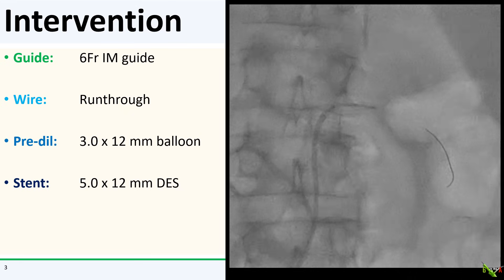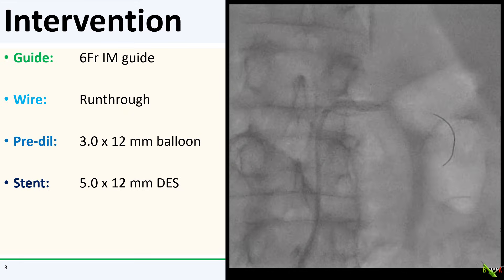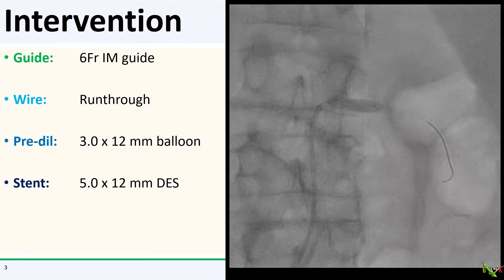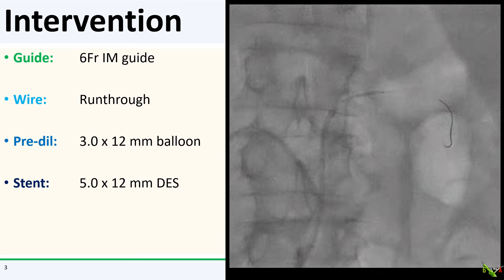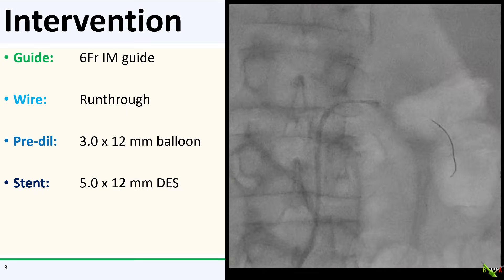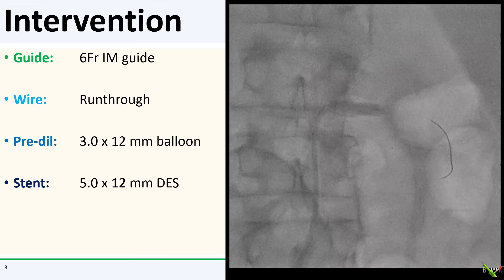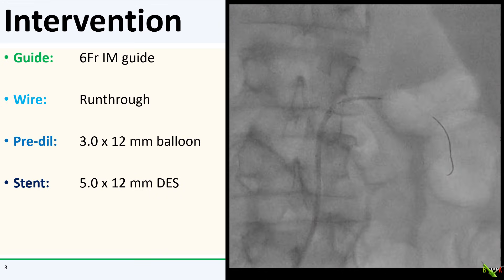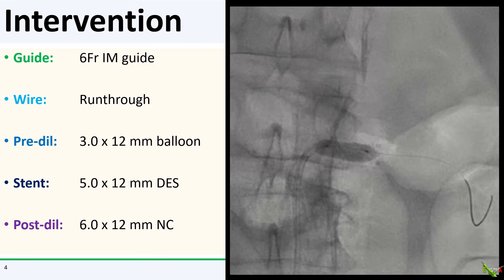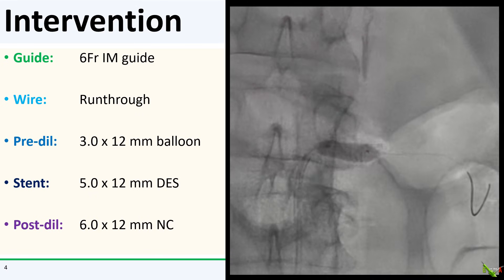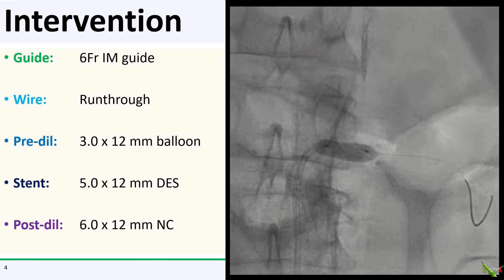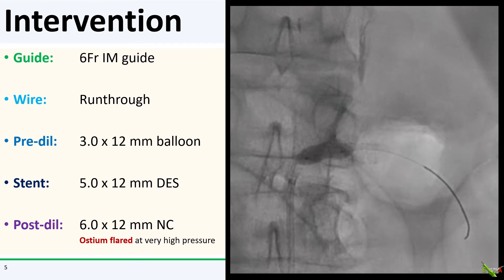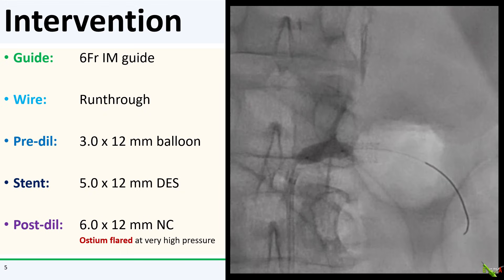The left renal artery was engaged with a 6 French IM guide. The lesion was easily wired with a run-through wire, pre-dilated with a 3.0 by 12 balloon, and stented with a 5.0 by 12 drug-eluting stent, which seemed to expand well. Here is the post-dilation with a 6.0 by 12 non-compliant balloon. The ostium was flared with the same 6.0 balloon at very high pressure, and things seem to be expanding well.